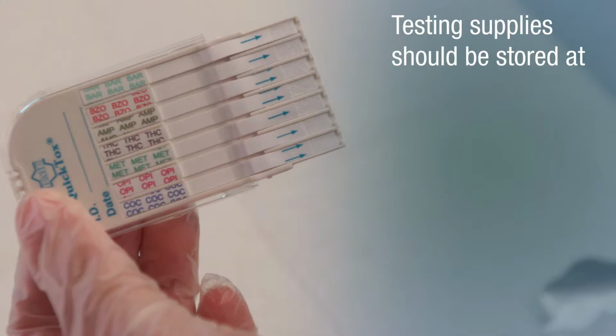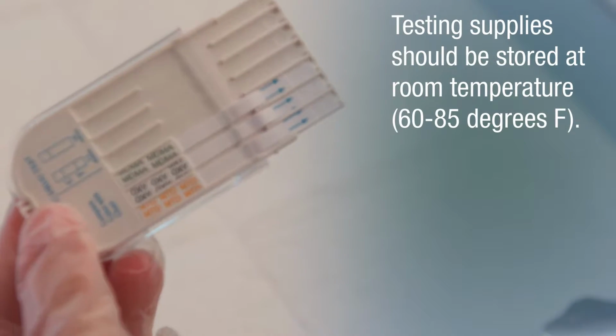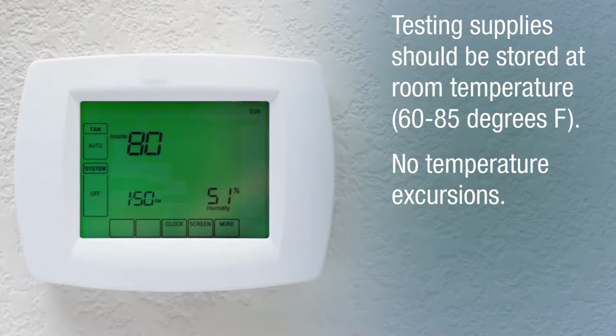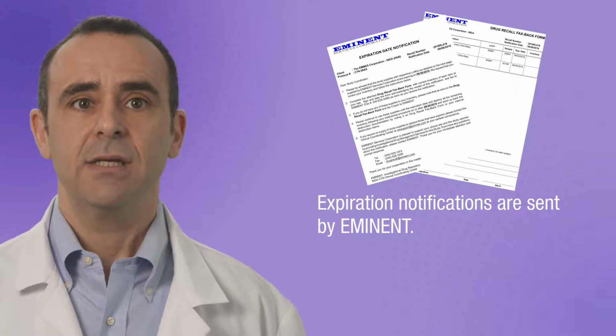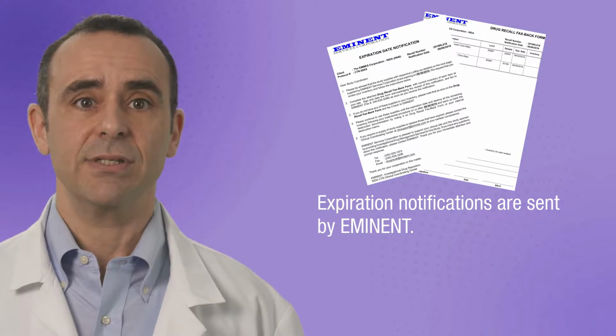The QuickTox drug screen dip card tests should be stored at room temperature, 60 to 85 degrees Fahrenheit. Verify that the supplies have been stored appropriately, with no temperature excursions outside of range, and the test dip cards have not expired. Notifications of expiring materials are sent by Eminent, the central distributor for the Clinical Coordinating Center, CCC, at EMMES.